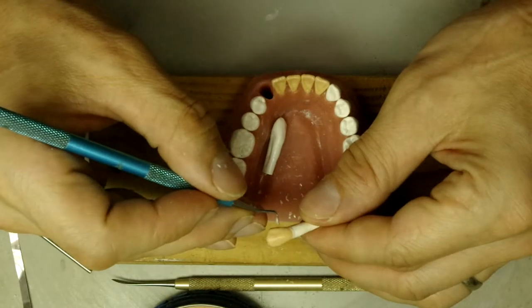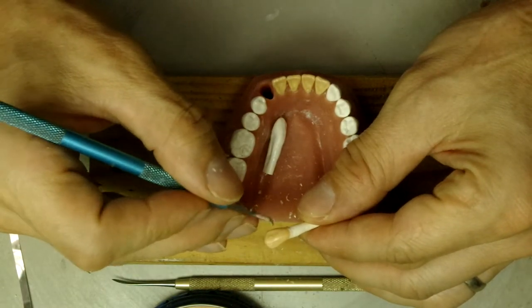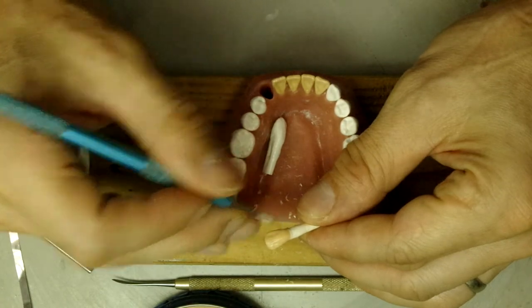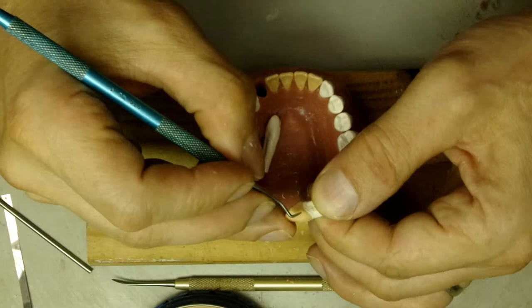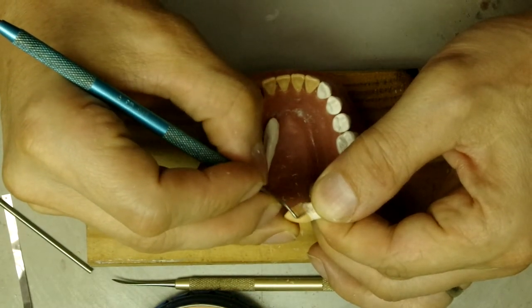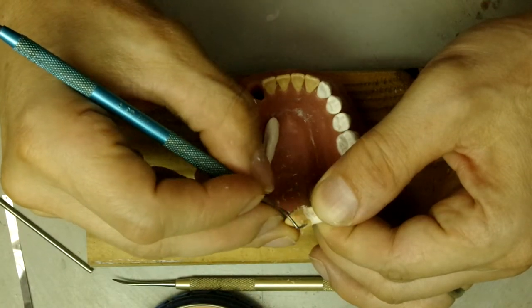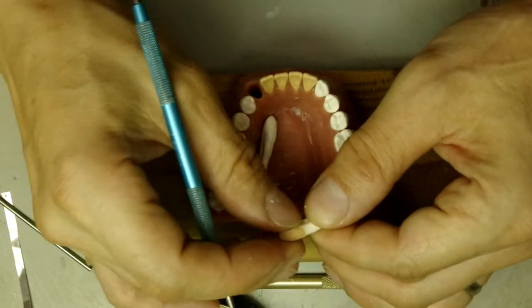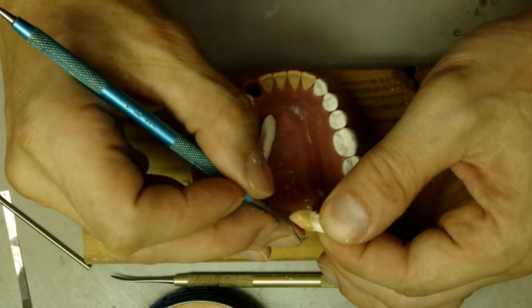The distal portion here, I feel it's a little bit too straight, so we're gonna make more of an S curve on there. So we're gonna thin out the cervical area a little bit. Just don't take the wax off the margin, please.